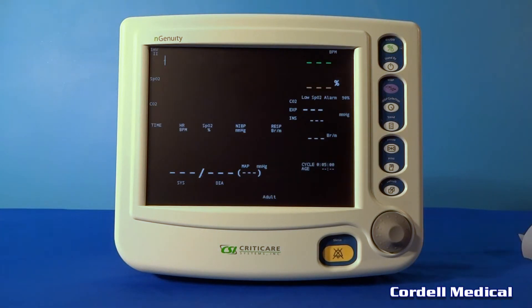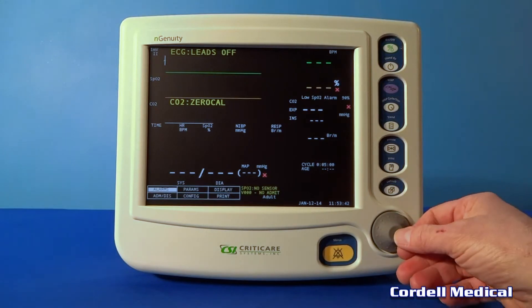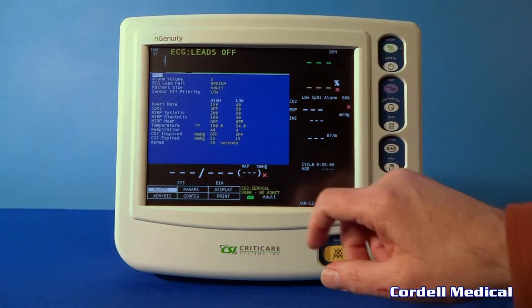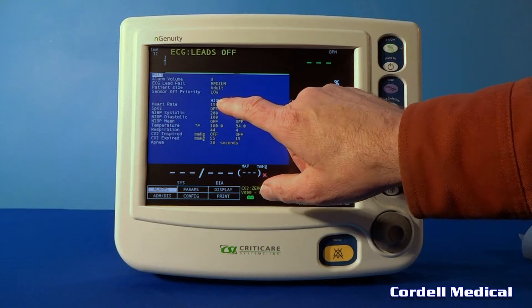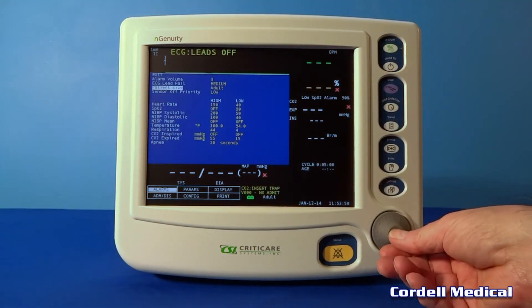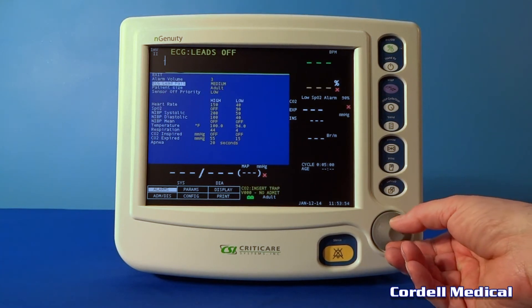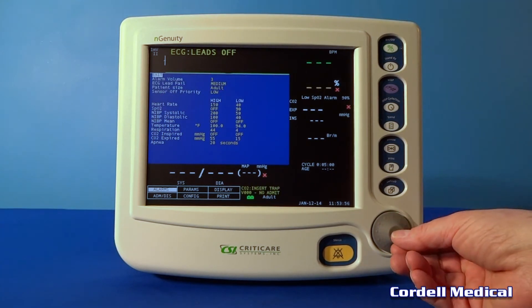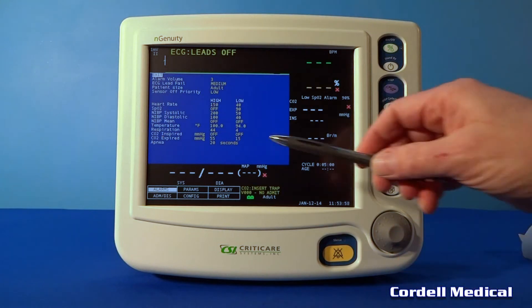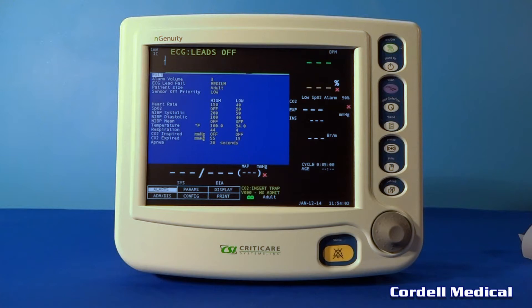Every time the monitor turns on it performs an auto calibration lasting about 10 seconds. Right now we're just scrolling through the different screens. That's the alarm screen — you can set the different patient sizes at this point, with high and low alarms that you can set here. Press escape.